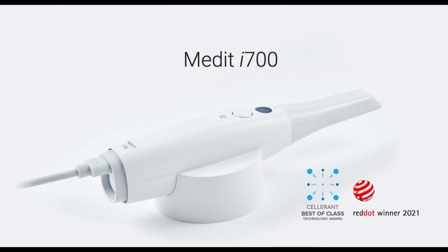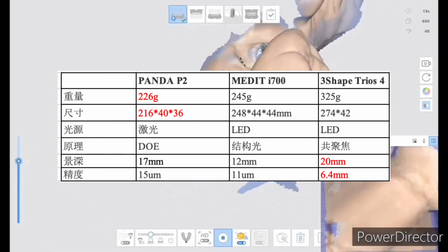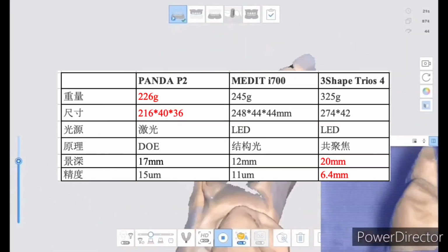Compared with confocal technology, the cost is greatly reduced. The terminal price of MEDIT is about $12,000. The laser diffraction technical scheme includes a laser generator, a decoherence device and 2 cameras. The cost is equivalent to that of 3-dimensional structured light. The P2 terminal price of Panda is about $7,500. Finally, let's compare the paper parameters of the product.